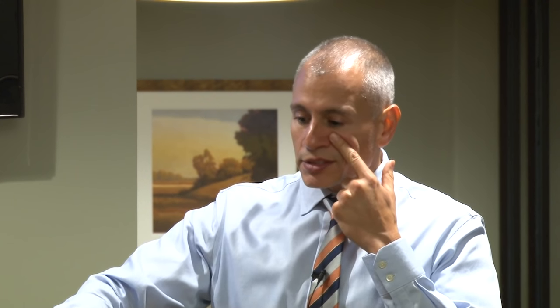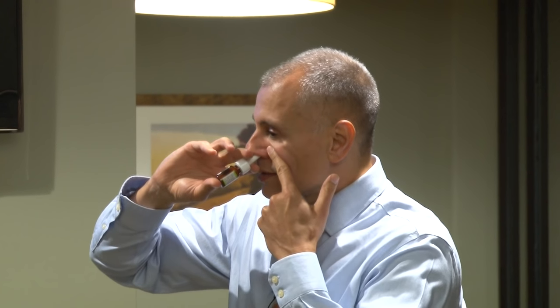You might need to sniff a little bit to keep the medication up in the nose. The proper angle is up and slightly out — almost towards the corner of your eye is where you're trying to get that angle.